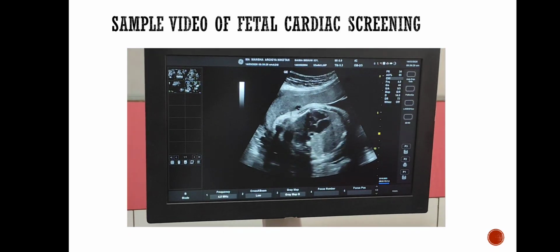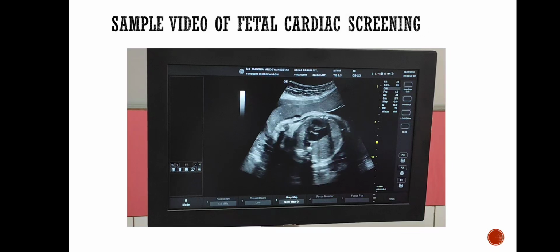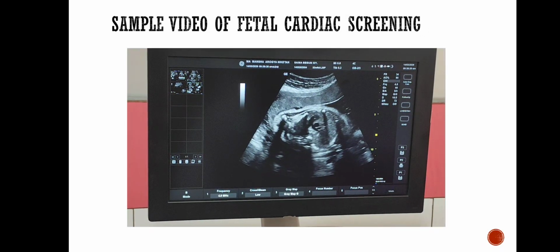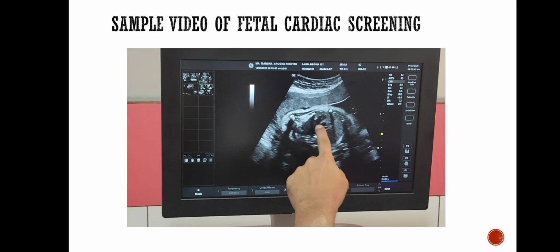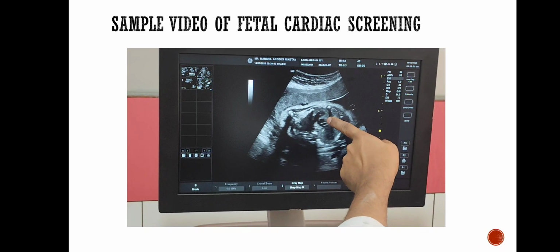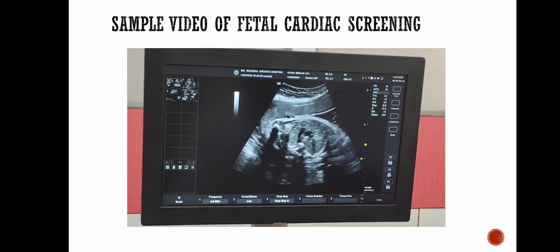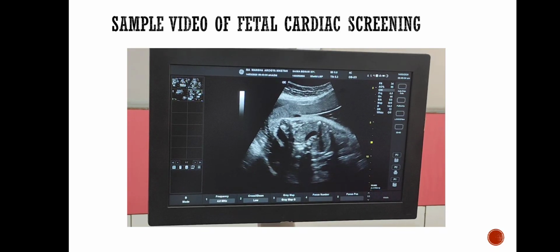Then fourth chamber view, then LVOT, and coming to the cephalad position. This is right ventricular RVOT, branching, abdominal aorta, SVC. This is three vessel tracheal view.